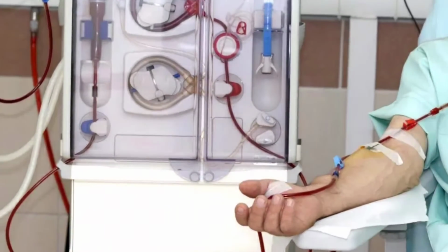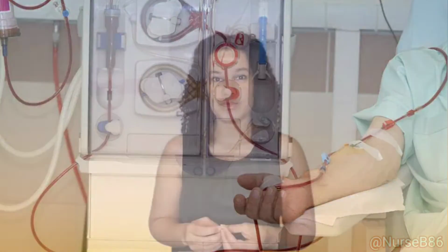So this topic is going to continue on from the last one of treatment options, and I am going to be focusing today on hemodialysis or HD. As I said in the last video, hemodialysis is one of the treatment options available for people suffering from chronic kidney disease or CKD. It's the process of removing waste products and excess fluid that has built up in the body once the kidneys have stopped working. Essentially, this is doing the job of the kidneys, but only a fraction of it.